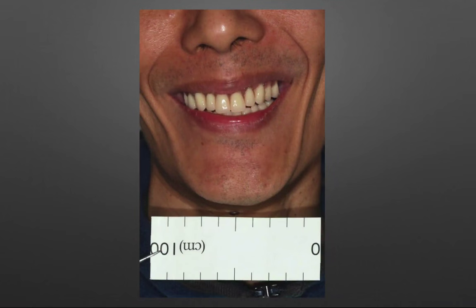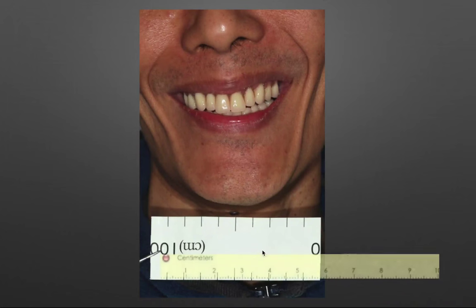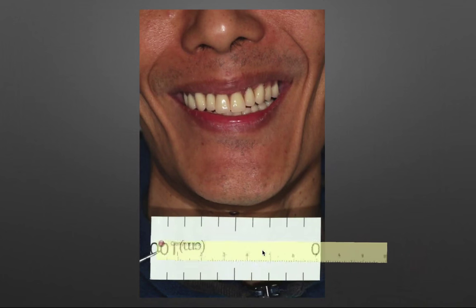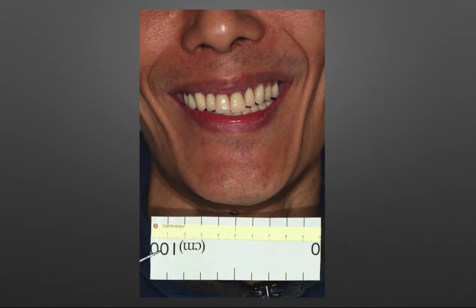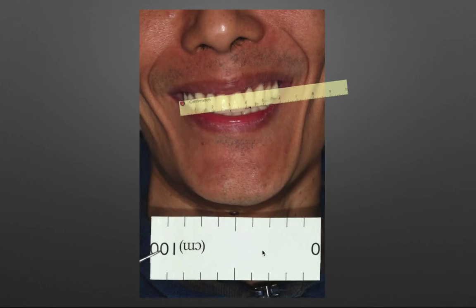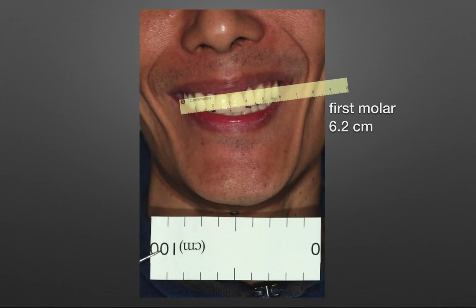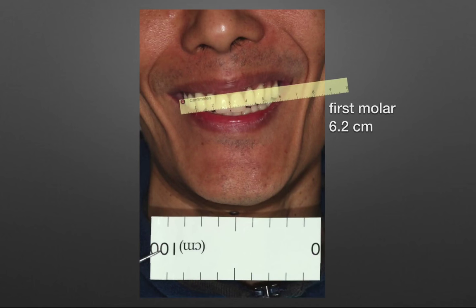Let's practice one more time. This is another case. First, import the digital ruler. Calibrate it. Make your smile width measurement. Then send this information to your technician. This is quick and easy.